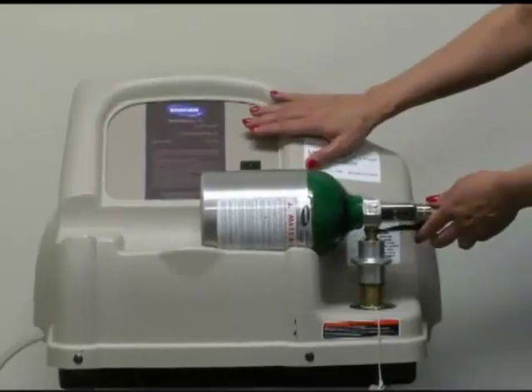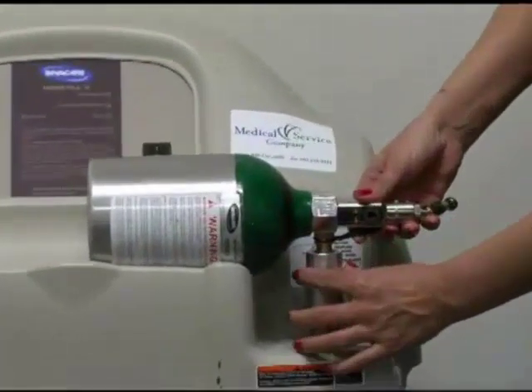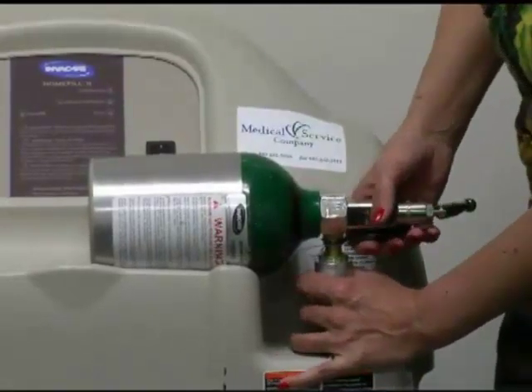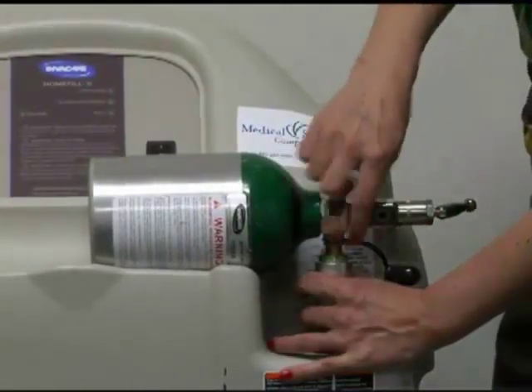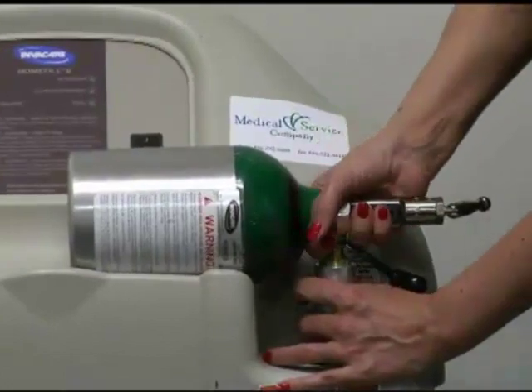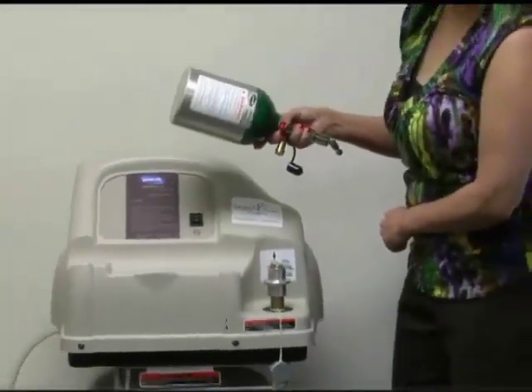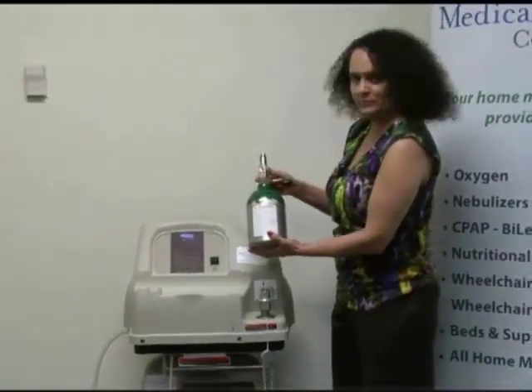Once your tank is full, to remove it you push down on this gray connector and just slide it down. You can see the little green dots again, and then you can just lift the tank right off. And it's that simple to fill your home fill tank.